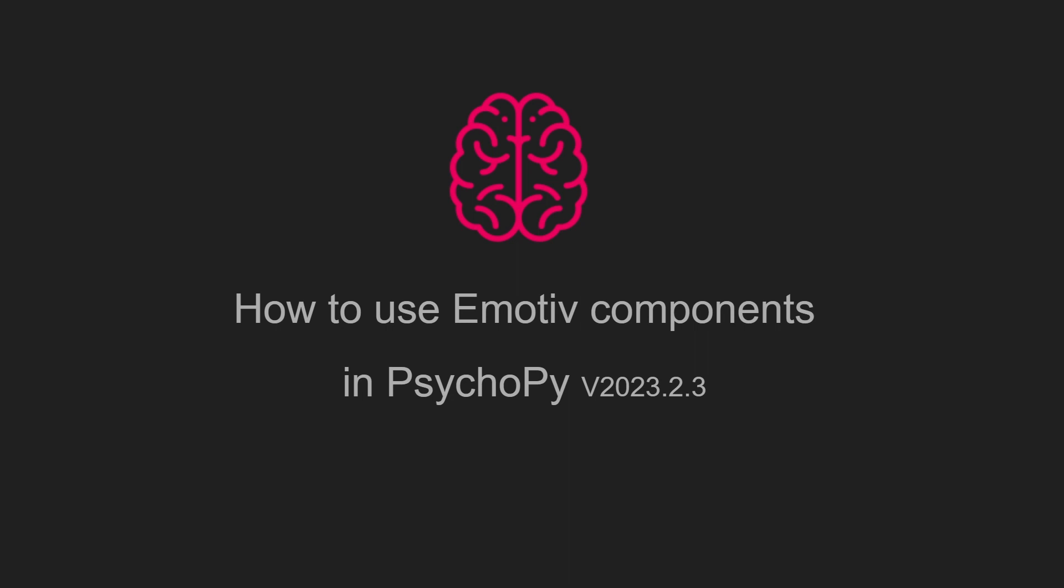In this video, we're going to build an auditory oddball experiment using Emotive marking components in PsychoPy version 2023.2.3.